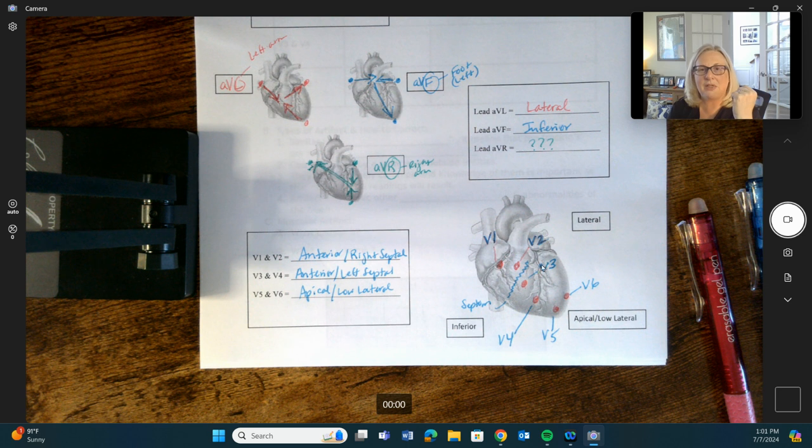So it might be in this artery here or one of these arteries. So the cardiologist knows exactly where to check. It's crucial. It saves viable minutes, sometimes life-saving minutes when you're dealing with someone having a heart attack. So EKGs are super important when it has to do with heart emergencies.